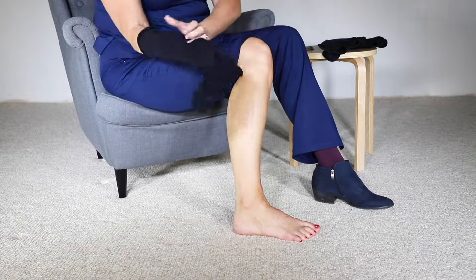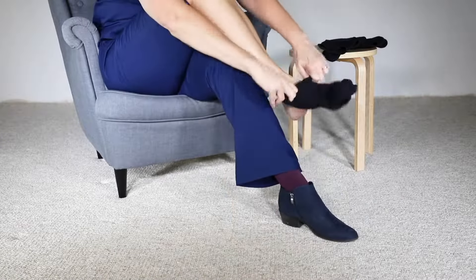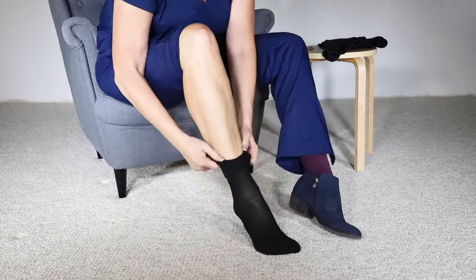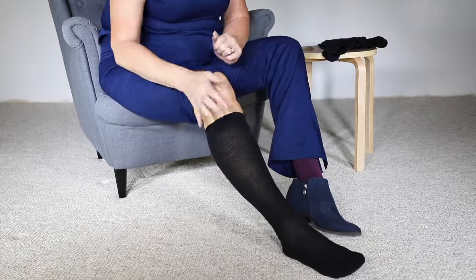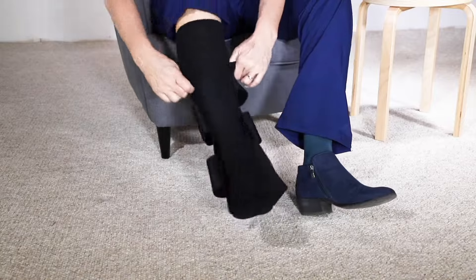Begin by donning one of the supplied liners. It may be easier to fold the liner in half as shown, or simply pull the liner on. With the stretch panel facing forward, slide your leg into the wrap.